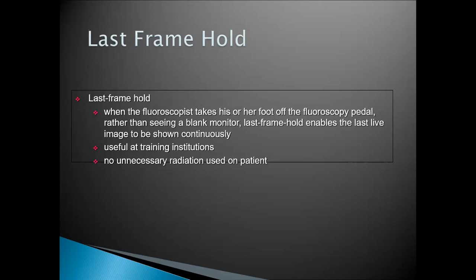What to do is just engage the last frame hold, stop there, and look more intently at the image on the monitor.